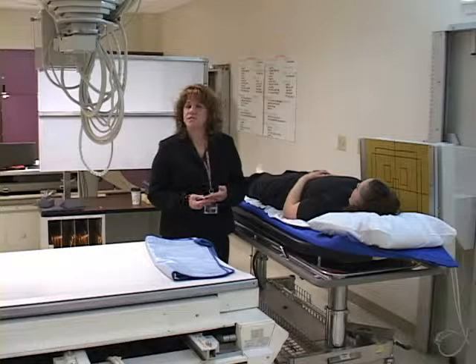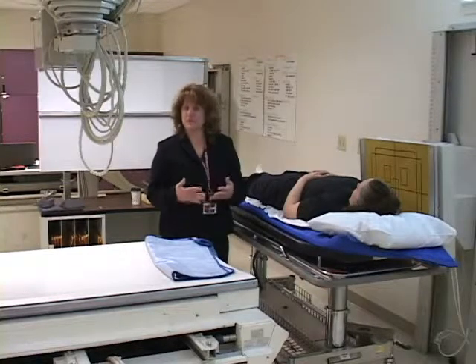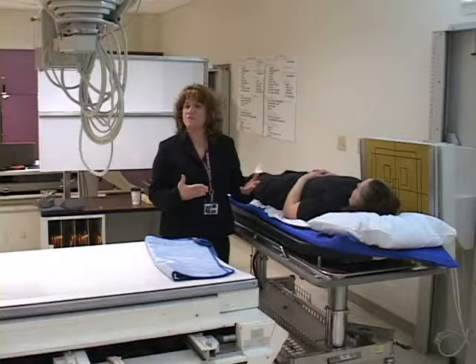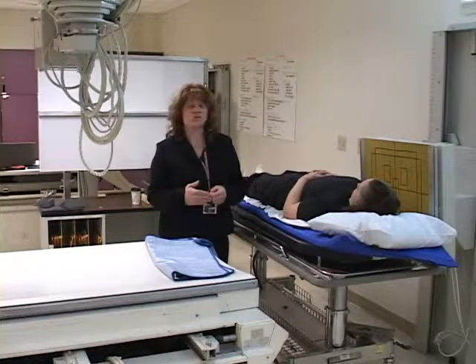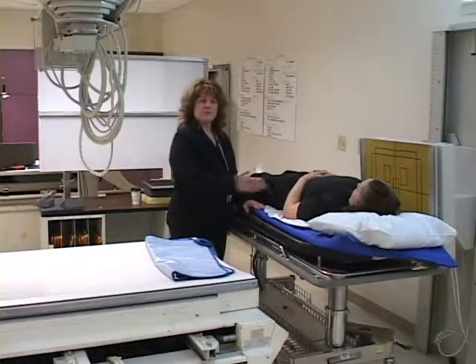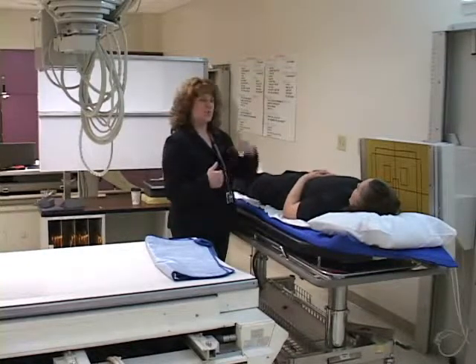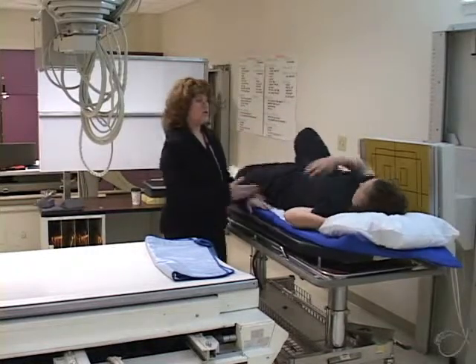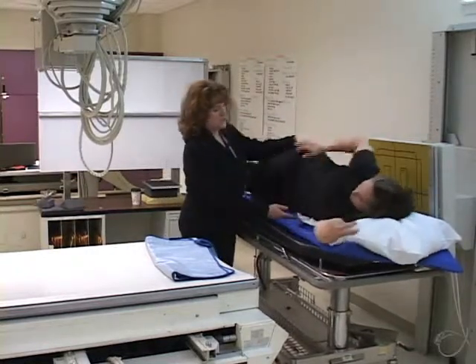A decubitus chest is typically somewhat difficult to do. It is usually used for patients that are unable to stand. So I will have brought my patient in on the gurney. I will have them either roll up towards me or away from me, depending on the view that the radiologist has asked for. So I'm going to have Heidi turn up on her side.